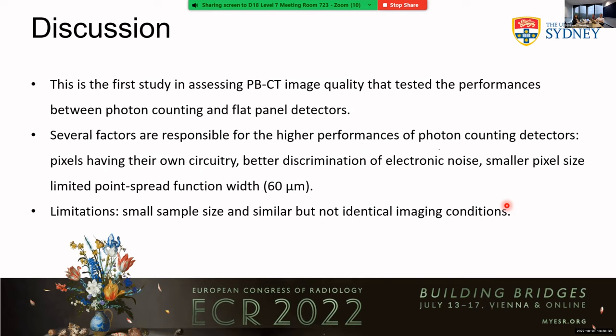Again, using a synchrotron facility, the nature of the X-ray beam is monochromatic, and therefore a single energy is used throughout. But the potential of single photon technology can really leverage energy-based color-coded maps that can be applied to the images generated if applied to a conventional X-ray tube using a non-monochromatic X-ray beam.